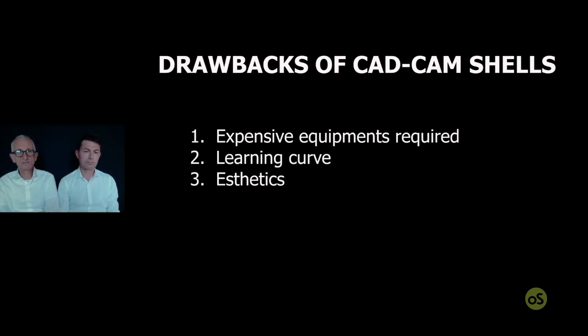And obviously this machine will be used to make a number of things. But even so, compared to taking a couple of alginate and sent to the lab, it is definitely a procedure that requires to have some budget invested.